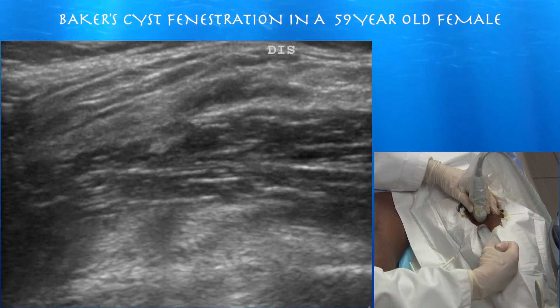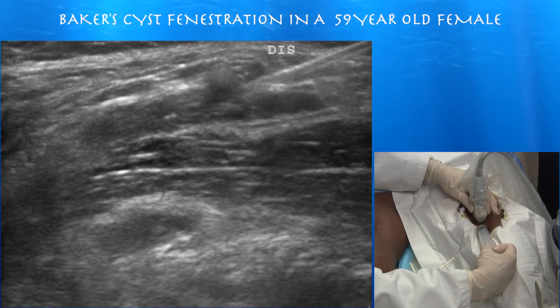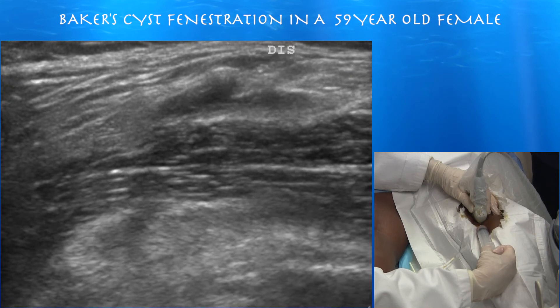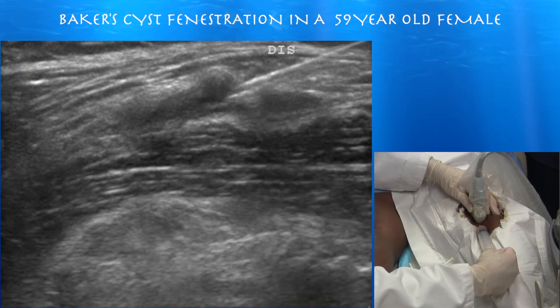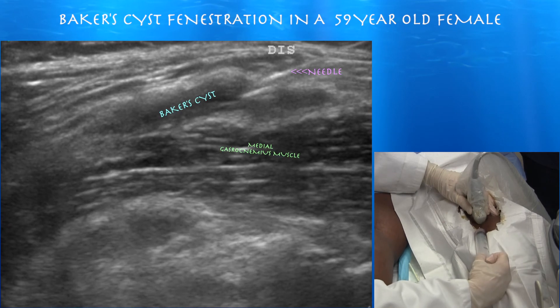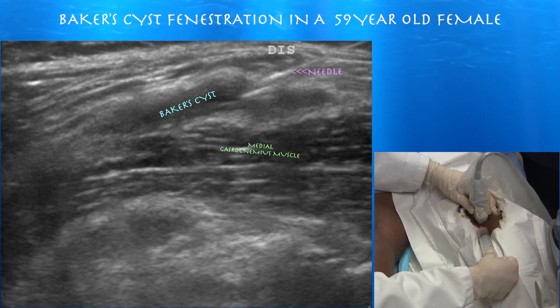Trying to drain the rest of it. Here's what was left of this cyst — I think it was filled with thick ganglionic-type fluid, which you sometimes see in Baker cysts. We're still trying to fenestrate it, mechanically breaking up the inferior wall. Sometimes you get this thick, gelatinous ganglion-type fluid in there.